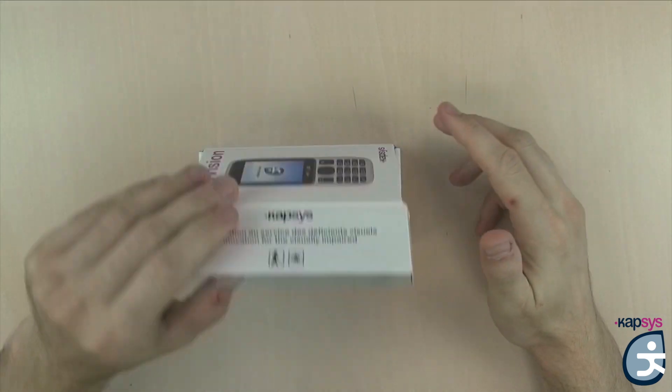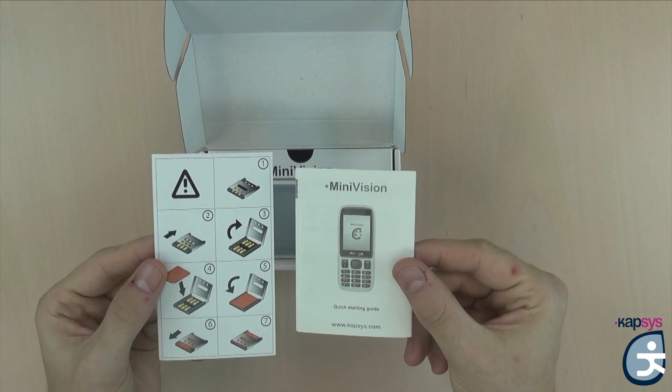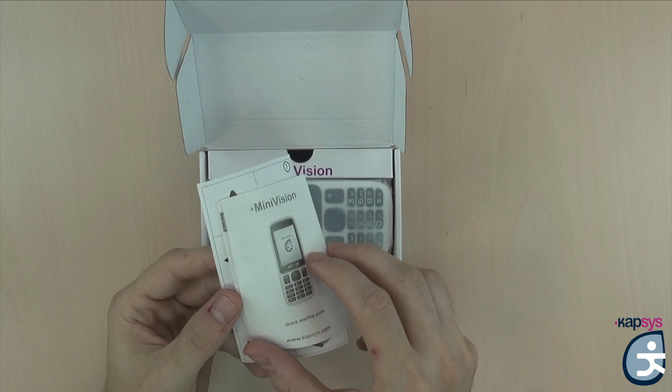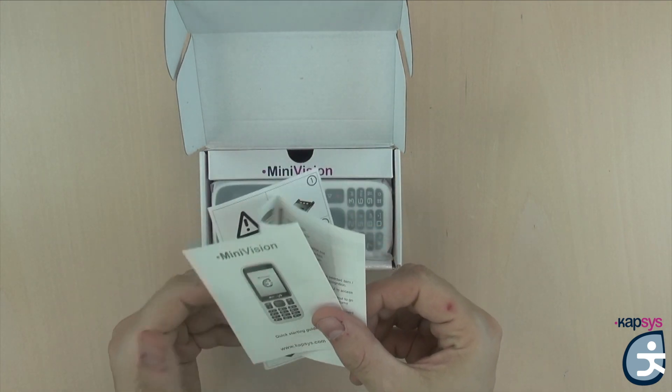The first item you will find in the box is the quick starting guide. This guide will allow you to know the functions of the various keys on the phone as well as some important information: how to put the battery, how to insert the SIM card, how to charge the product, legal notices, etc.